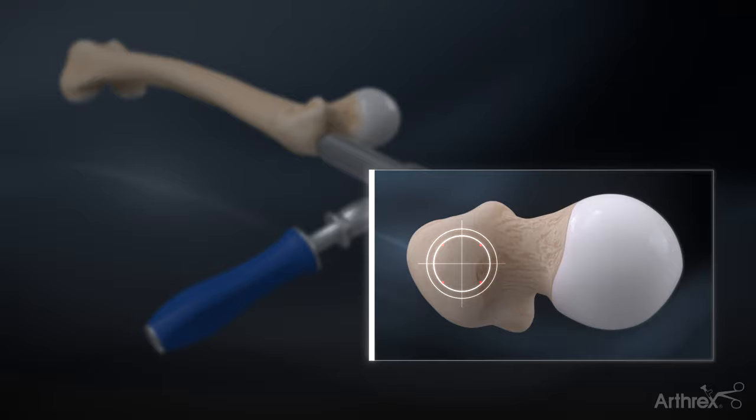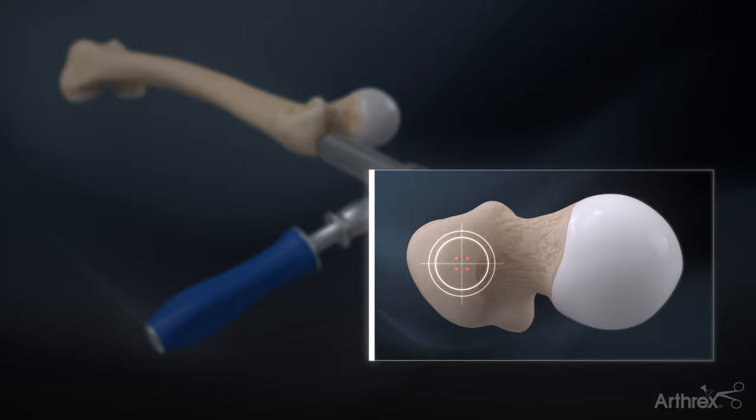Determine the entry point for the nail at the tip of the greater trochanter. This point may vary slightly depending on the patient anatomy and fracture pattern.